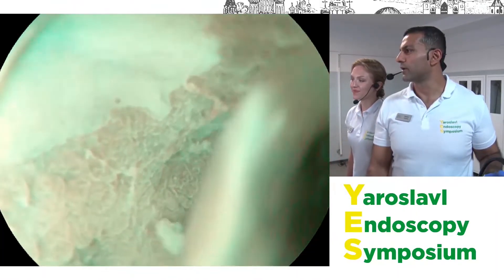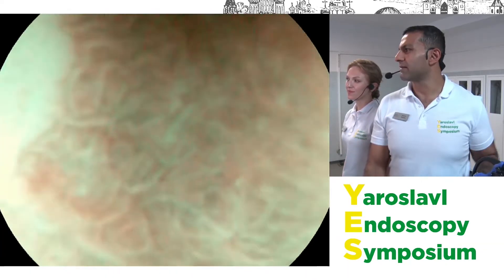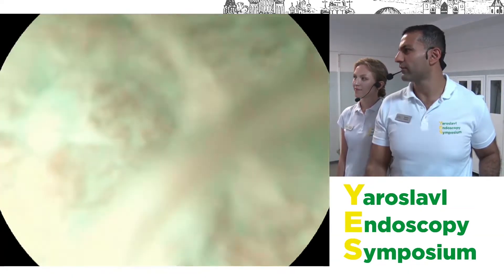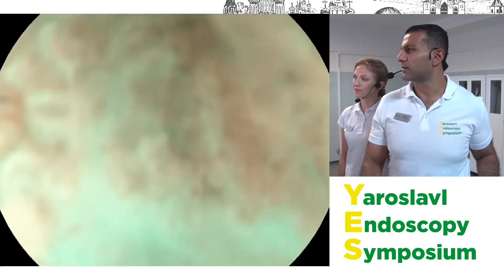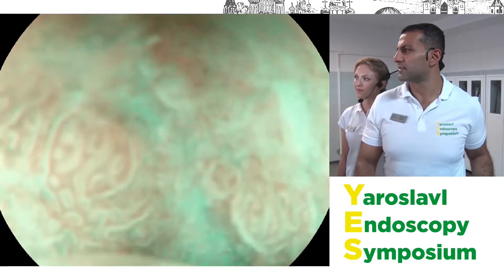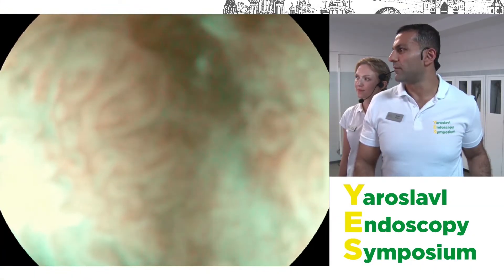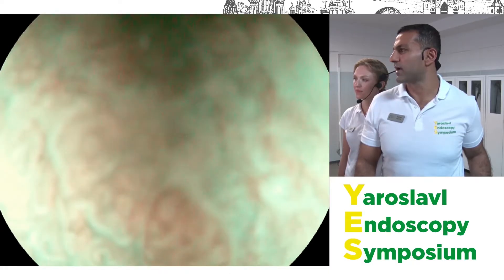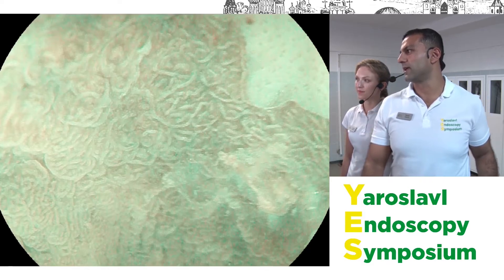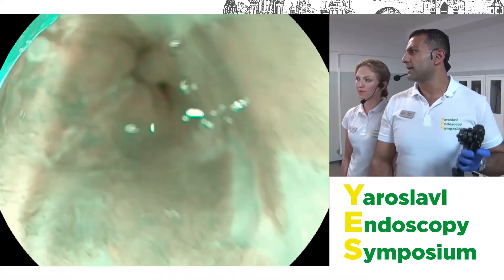Natalia confirms there are no visible lesions, and I agree. Over here there might be a little low-grade dysplasia — a few areas that look slightly irregular and amorphous. With underwater chromoscopy and the correct focal length you can really see the pits in a lot of detail. This is the benefit of this endoscope: if you wash the mucosa and take your time, you can get very stunning pictures of the micro-mucosa.